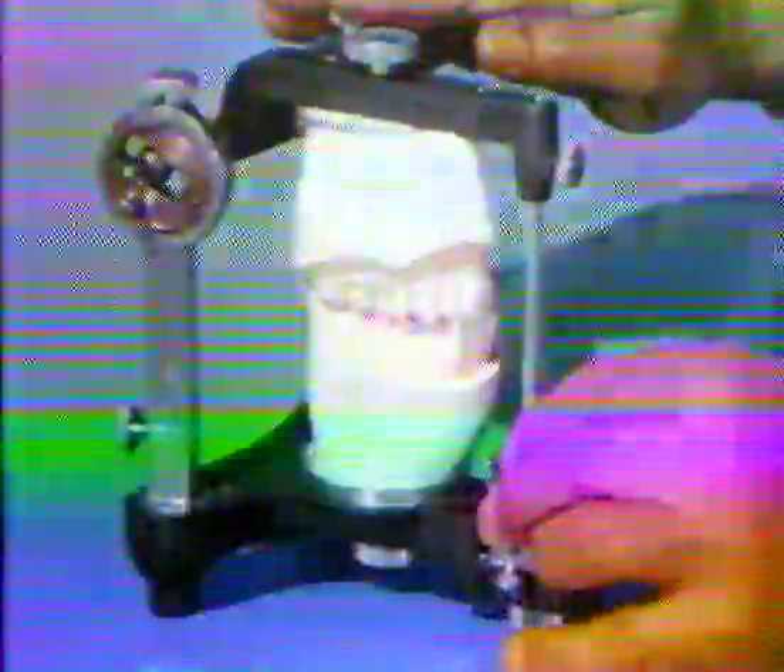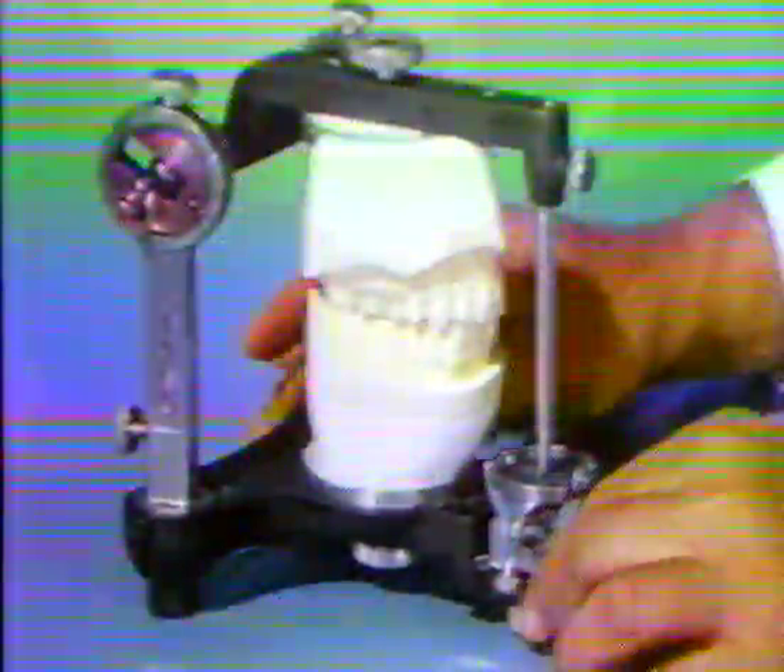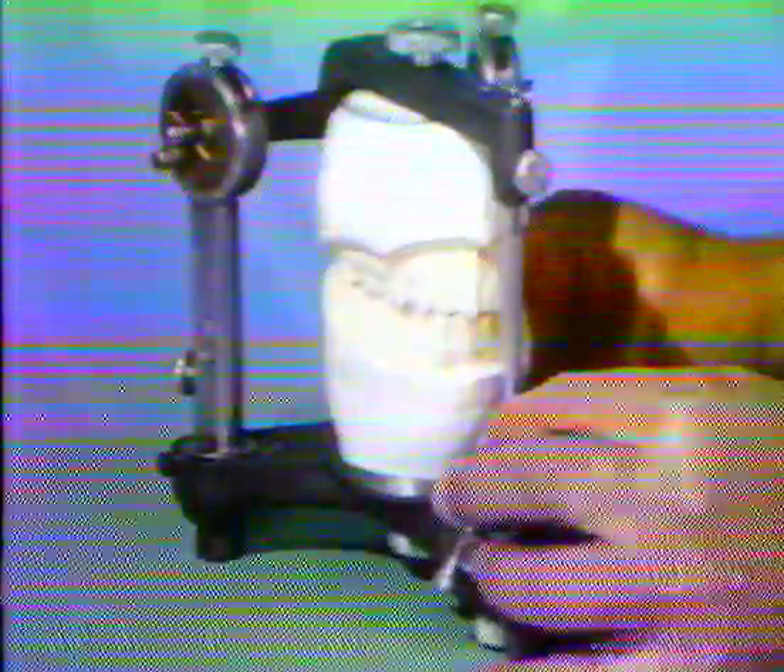Careful clinical analysis of occlusion should always precede and be part of the analysis of the mounted cast. The simple procedures for mounting casts illustrated in this movie will provide the essential information that can be gained from mounted casts, even though technical limitations regarding reproduction of complicated jaw movements in articulators tend to restrict the significance of all articulator analysis of occlusion.